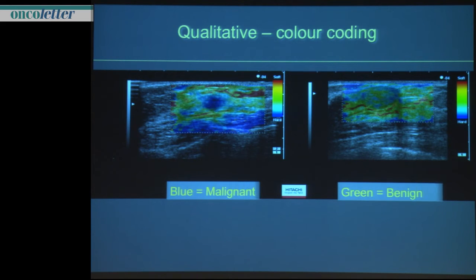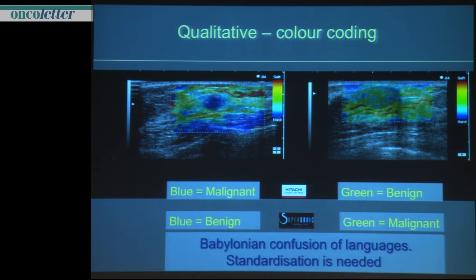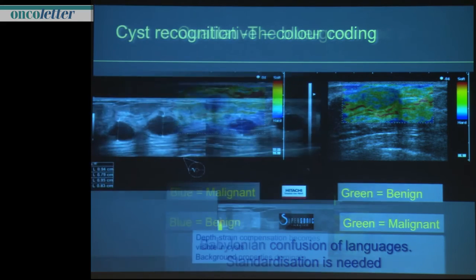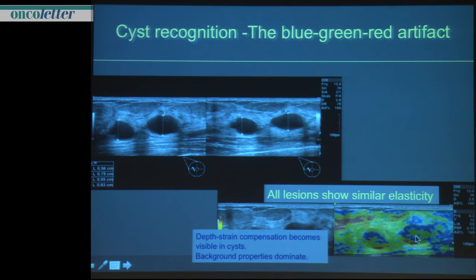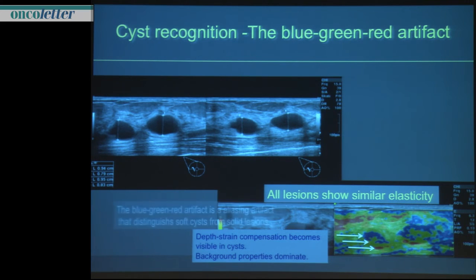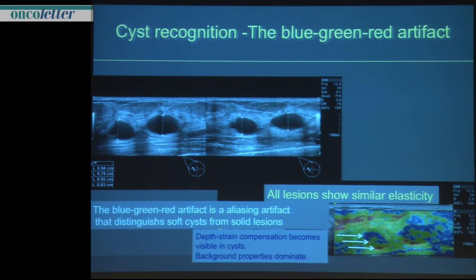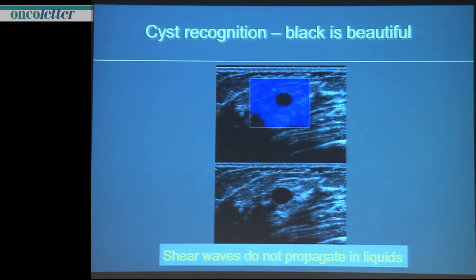Color coding is a problem — it differs between Europe, the US, and Asia. But modern systems allow you to switch: is red hard or is red soft? A typical artifact in strain imaging appears within cysts as a blue-green-red pattern. Whenever you see this artifact you know it's strain imaging — it's a tricolor artifact defining a cyst. And this is the black cyst appearance in the supersonic shear wave system.